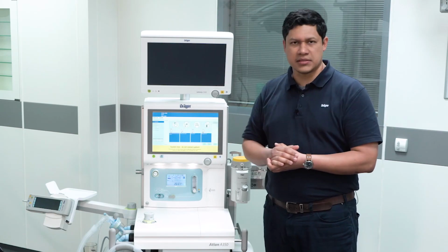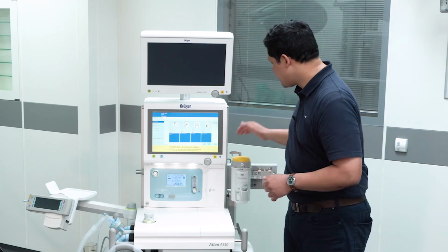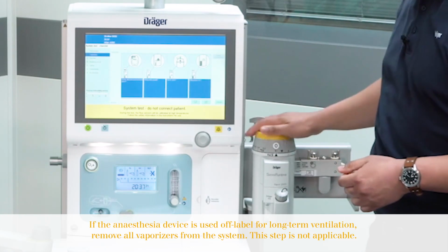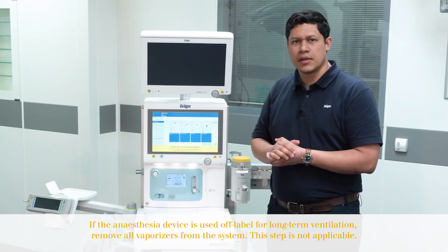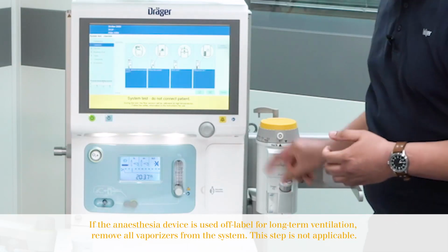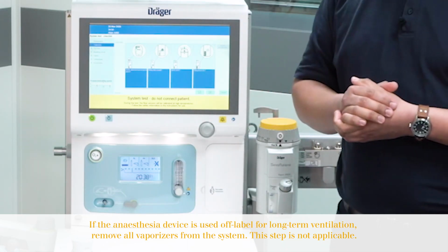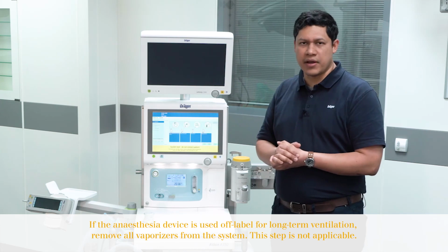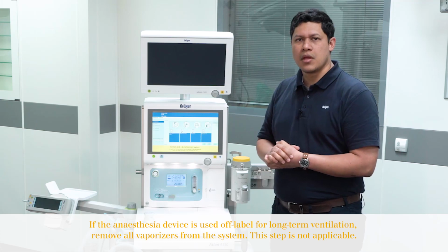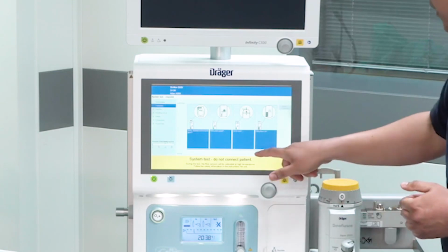The second group of tests are related to the vaporizer. First, you will have to make sure that the vaporizer is firmly attached and locked in place. The next steps are to verify that the filling cap is completely closed and it is set to the 0 position. The last element to verify is the correct filling level of the vaporizer. Once you have verified all the different test elements for the vaporizer, you press on the check sign.